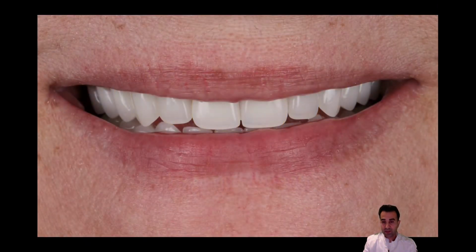That's the final. You can see the denture brought balance and harmony back to the smile. Thank you so much for watching.